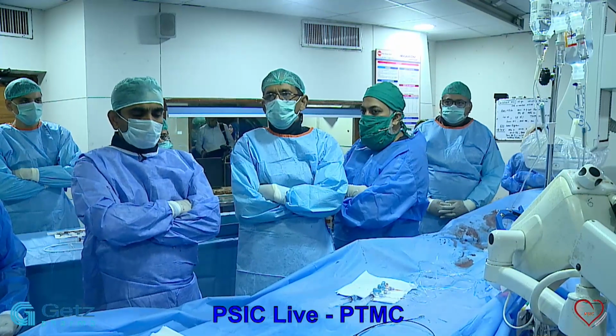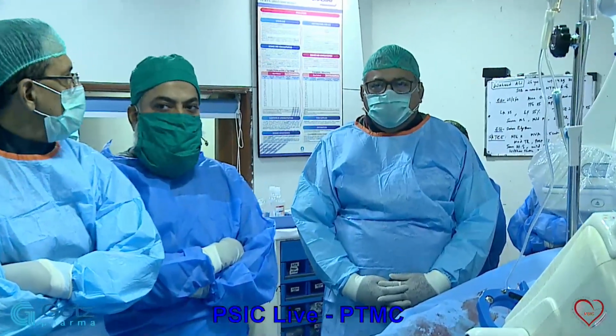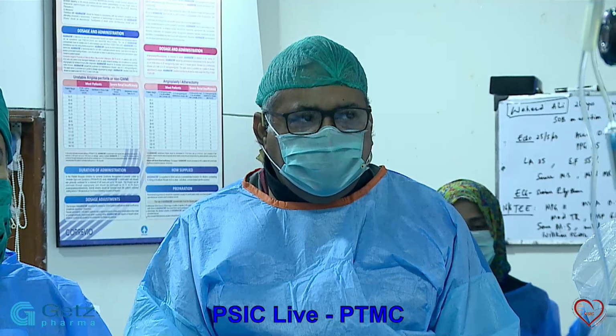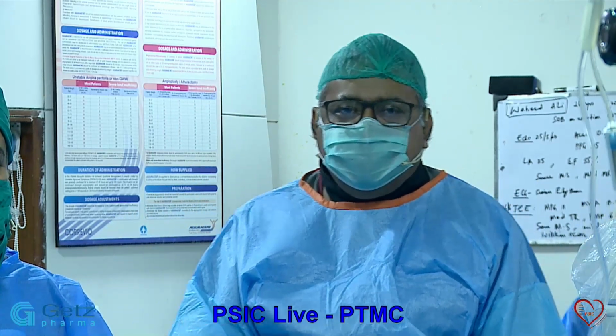My name is Professor Tahir Sagir. I welcome all cath labs over Pakistan from NICVD Karachi for the first live case from the Pakistan Society of Intervention Cardiology platform. From this year, we have started this activity of live transmission on a monthly basis. Every second week of the month, we'll be doing a live case from major centers of Pakistan.